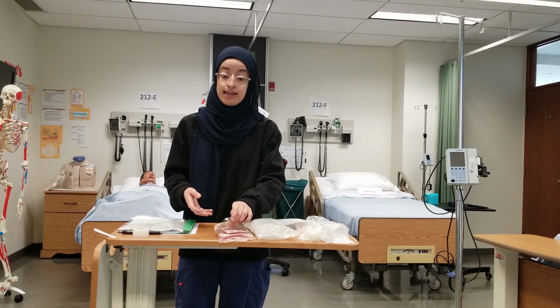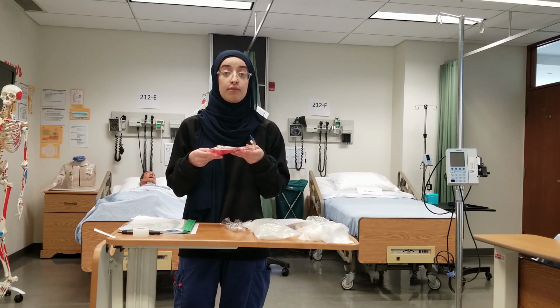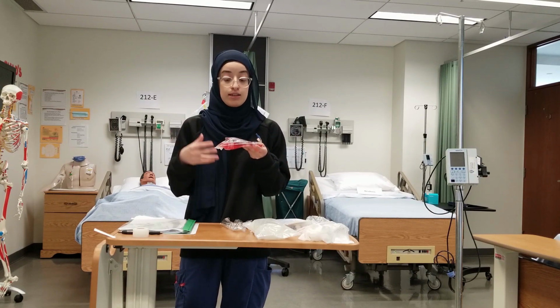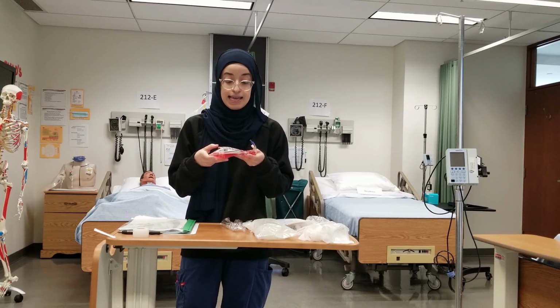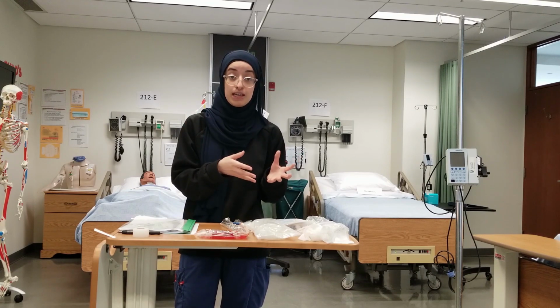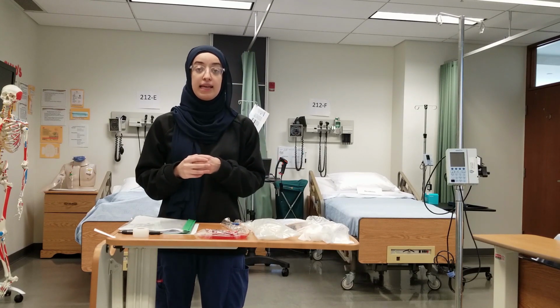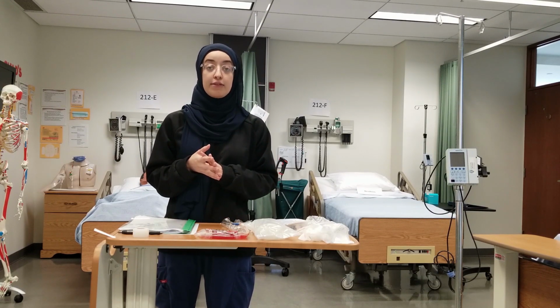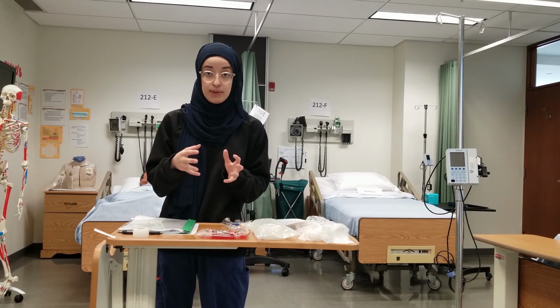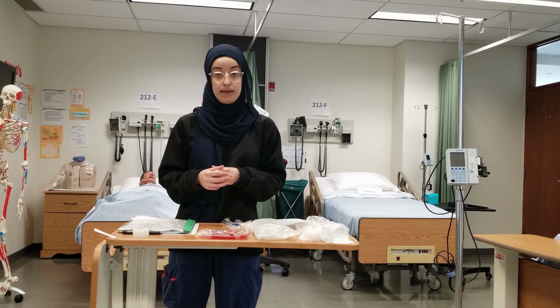The reason for that is when blood products are at the blood bank, there are special machines that help move and prevent the coagulation of blood. The second we remove that blood from those machines, the chance of the blood coagulating or hemolyzing increases greatly. So we want to make sure that blood is moving and moving into our patient before that can happen. Four hours is our other super important timestamp, and that is the time that all the blood needs to be infused by. After that point, if there's still any blood in the bag that we haven't infused, we need to stop the infusion and dispose of that because it's no longer good to give to the patient.